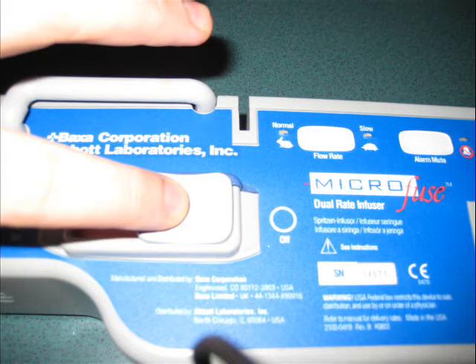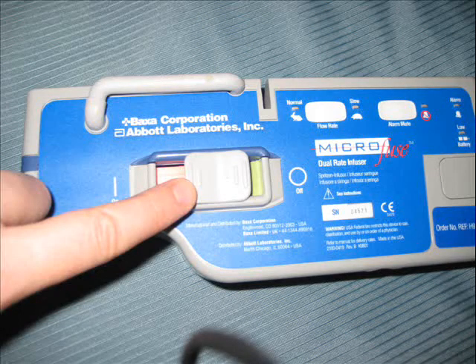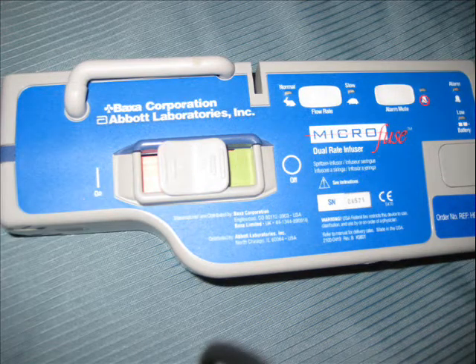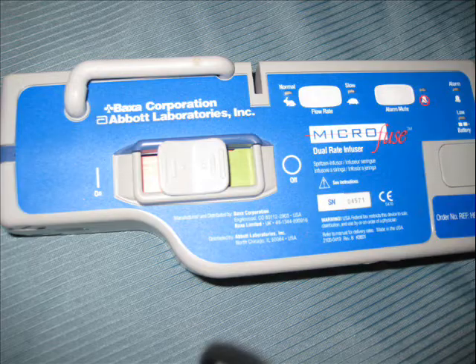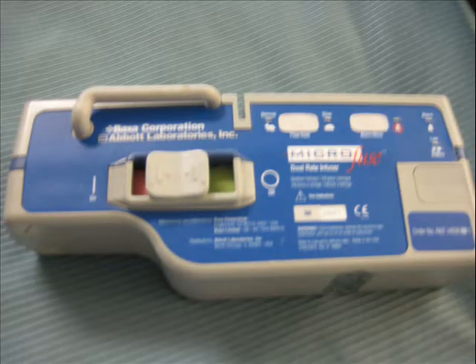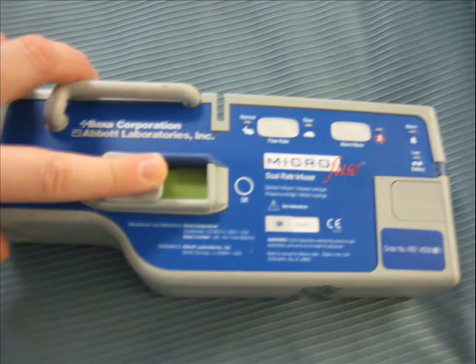In this closer picture, you can see that there is a button that slides back and forth between red and green. Red means that it is stopped and green means that it is running. In the upper right corner, you can see the rabbit and turtle button, which controls how fast you want it to run. You also have a button that silences the alarm. Moving back and forth between red and green will stop or start the syringe pump.